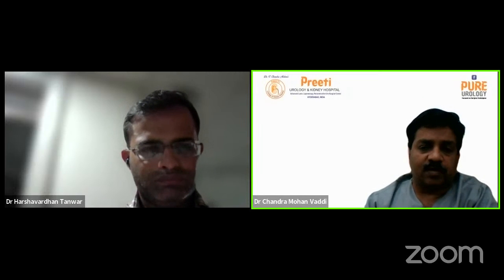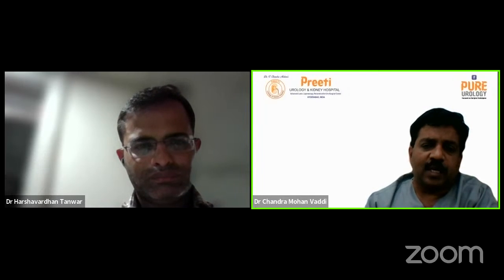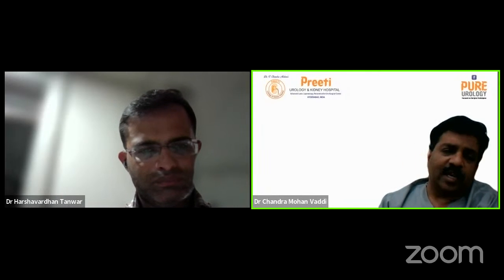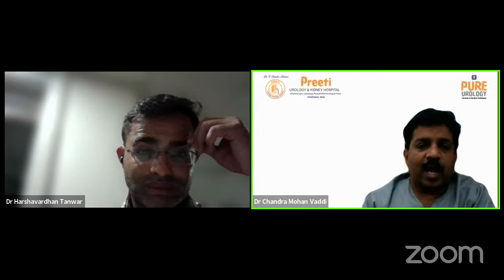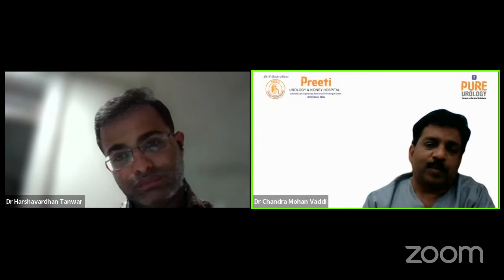And the last question, Harshawardhan: when you got training in KM, your bosses might have done PCNL, and you might have seen some other colleagues like Yogesh and all doing PCNL. Have they done monoplanar, for example Madam Patwalkar sir, Madam? Have they done PCNL in monoplanar, or have you only developed this technique?